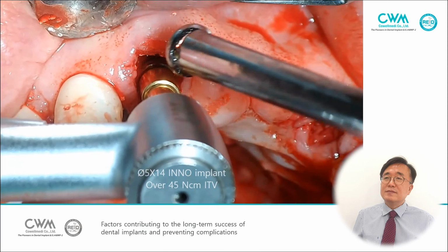You can check the implant placement depth, 4 mm.